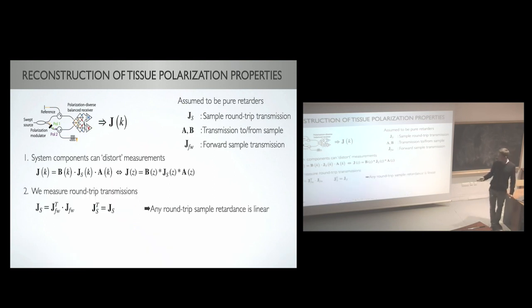Now, what I wanted to spend some more time on is the fact that we measure round-trip transmission matrices, which imposes an intrinsic symmetry, and I think that's important, along the point of Arthur this morning. This has important ramifications for our signal.